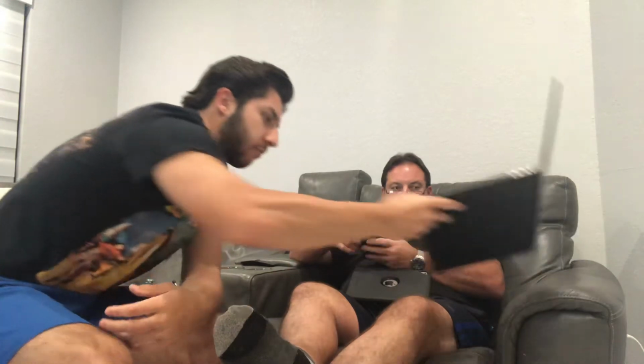Okay, now let's listen posteriorly. Again, using the diaphragm of the stethoscope, you're going to start listening at the apex and work your way down. And one thing to keep in mind when you're listening back here, you have the scapula, and you don't want to listen over those because you won't be able to hear the sound.